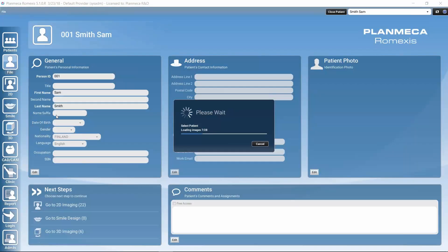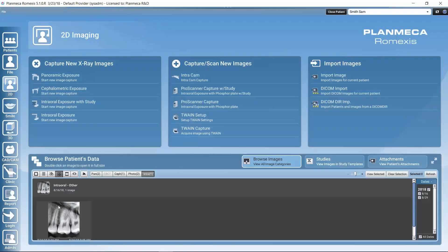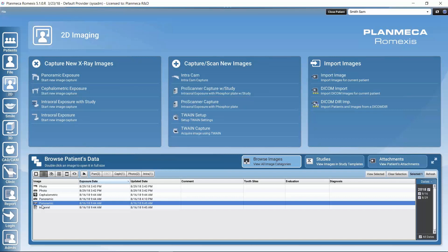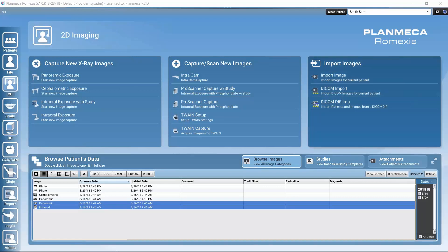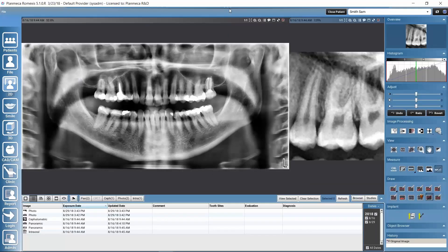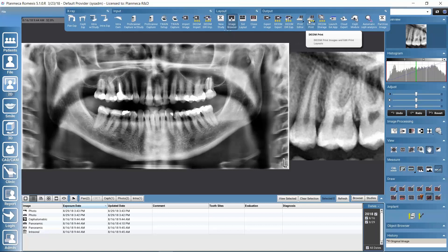If we open a patient, we can get to Print Editor both through the 2D and 3D imaging modules. Let's go first to the 2D imaging module. By keeping Control down we can select several images, then we can open them by selecting 'View Selected'. Here in the upper toolbar we can access Print Editor. Next to Print Editor there is also DICOM Print Editor, so if we have a license for this we can also print images with DICOM-compatible printers. But let's select the ordinary Print Editor now.